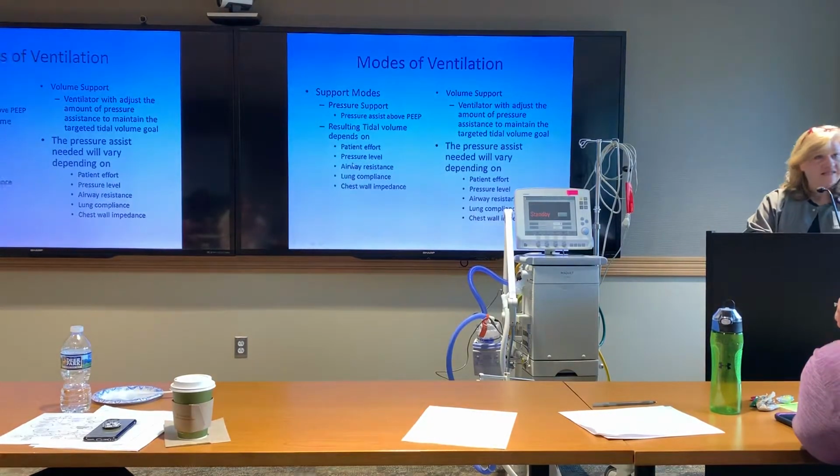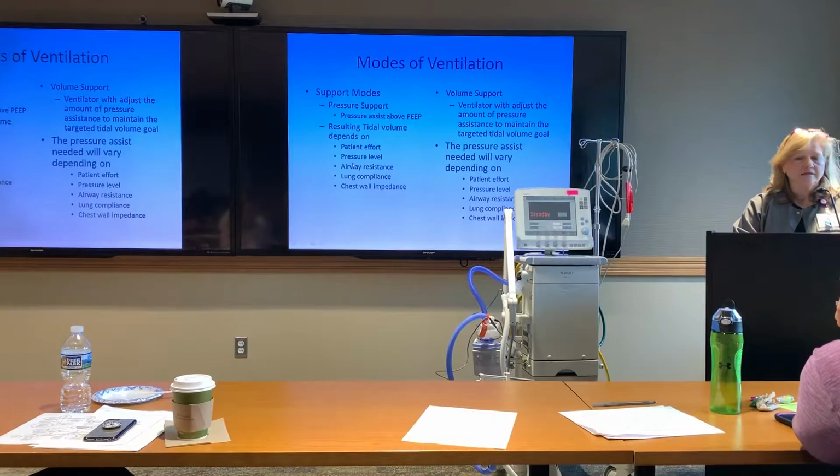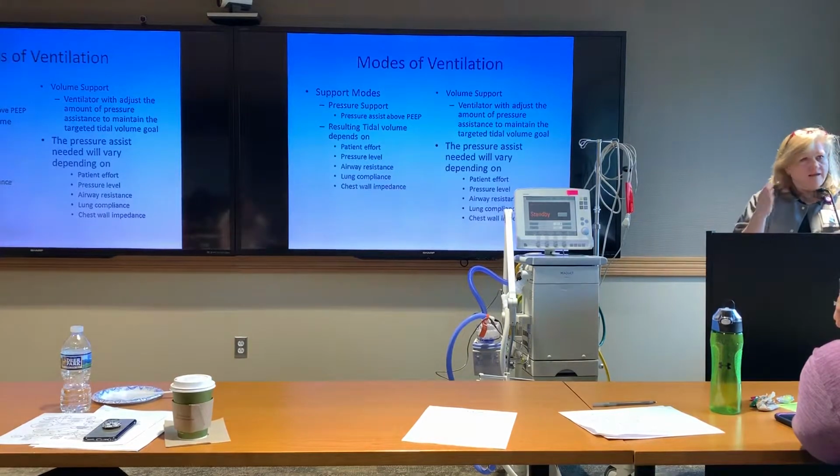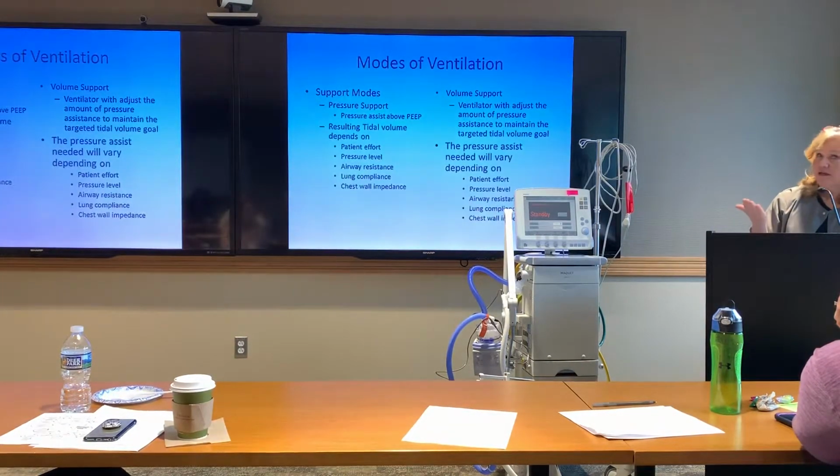If they get tired on it though, the respiratory rate starts to climb, the tidal volumes will start to drop, and they won't look as comfortable, so you may have to switch them back to assist control. But it is a good mode. It usually uses the diaphragm a little differently. It uses the posterior aspect of the diaphragm, so it does help in delivery and how the flow gets transferred through the lungs, which is a good benefit of it. So it's always a little bit of exercise for the lungs if you want to think of it that way.